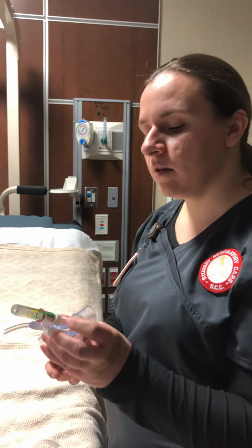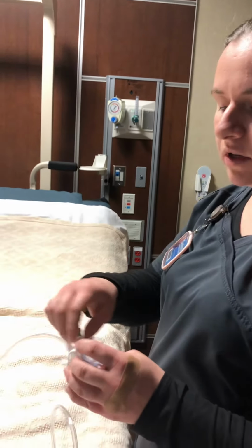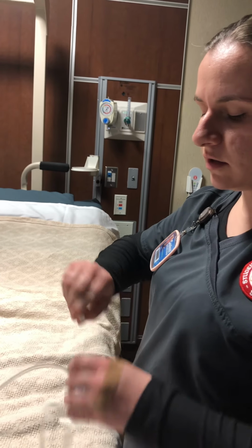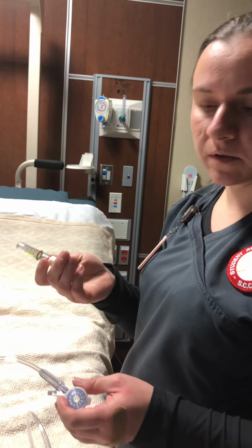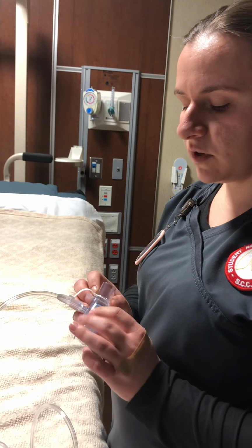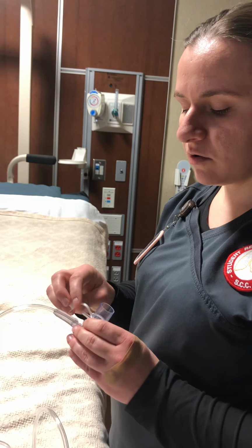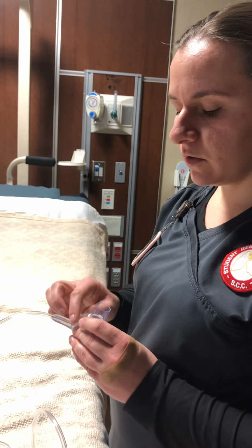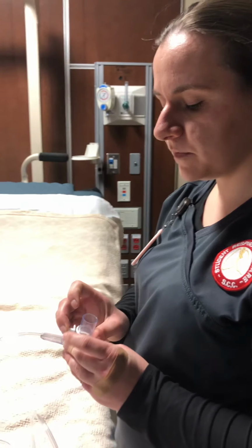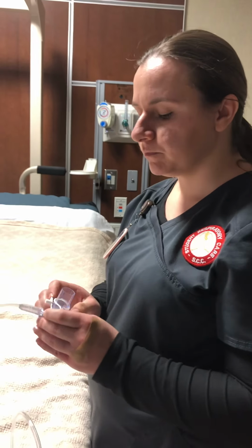And so after we do it a few times, if we're done with the meter, what you do is remove it like that. And this is disposable, so you can just dispose of that. And then if they're just doing a treatment with the EZ PAP without the manometer, make sure you close the port. That way you don't get any excess air through the port. That way you know they're getting the appropriate flow that they need.